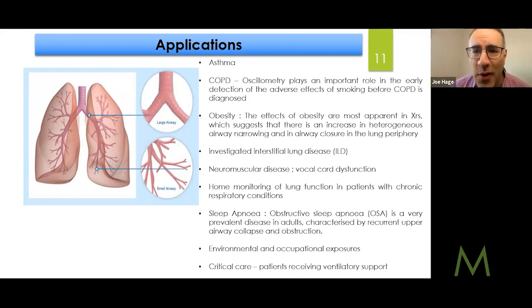I'm glad to call on you. I rarely see your hand raised. Yeah, hello from UK. So I just want to follow up on other people's comments and recommendations. In the UK and in the EU, we go through the health technology assessment pathway. I think the PICO method is a good way to use. You define the population, the intervention, the comparator, and also the outcome. And it's good to put the FOT in the clinical decision cascade.